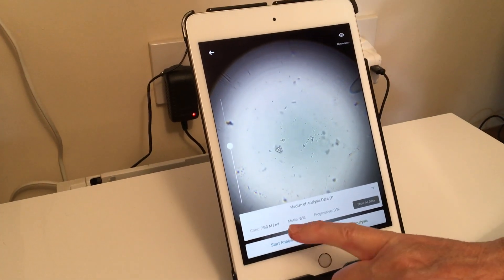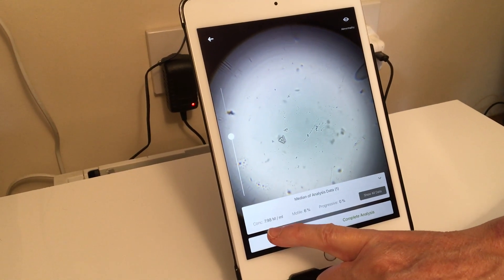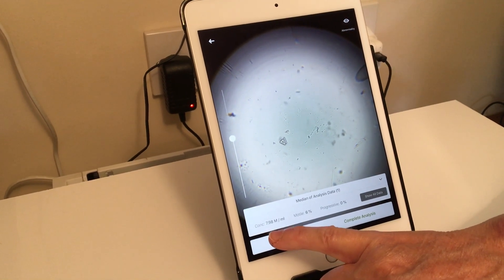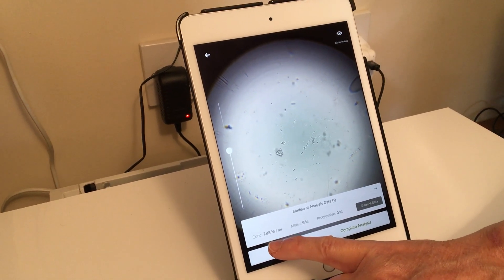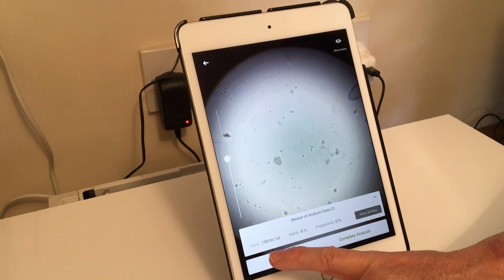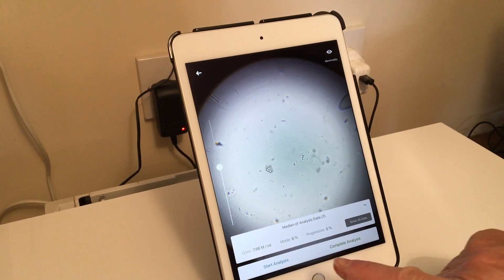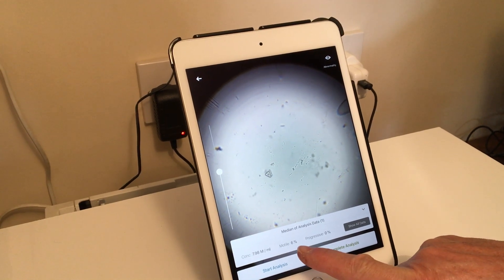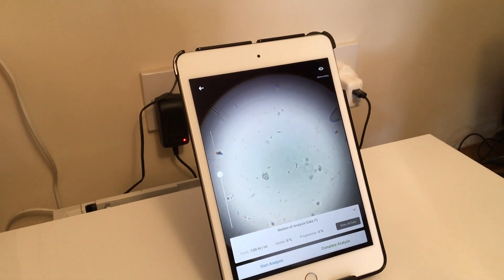Here we can see it gives us the concentration of the sample. This is actually a substandard sample - this is very poor, we wouldn't be recommending using this sample. It's a dog who is actually producing very small litters, so the owner was suspicious that there was a problem. It only has 6% motile semen, so a very useful tool for us.